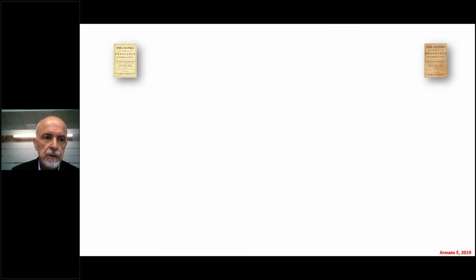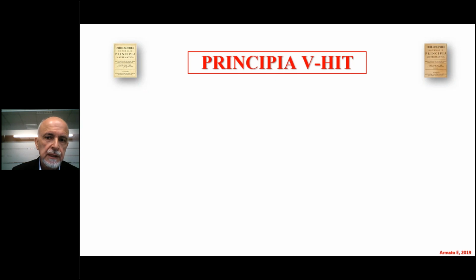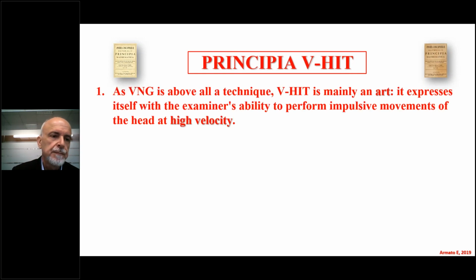Some reflections about the VHIT. I explain my principles. First, as VNG is above all a technique, the VHIT is mainly an art. It expresses itself with the examiner's ability to perform impulsive movements of the head at high velocity.